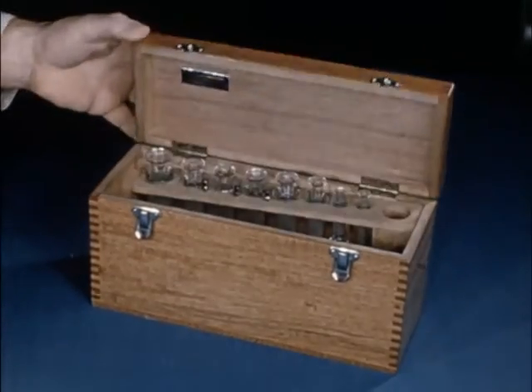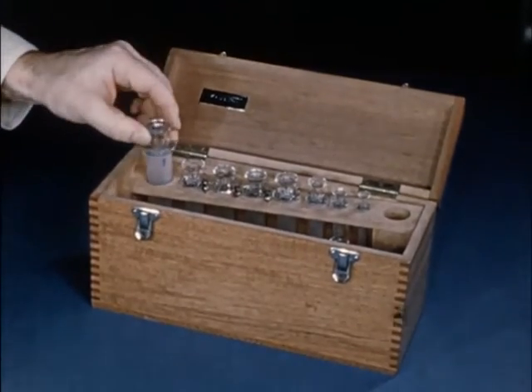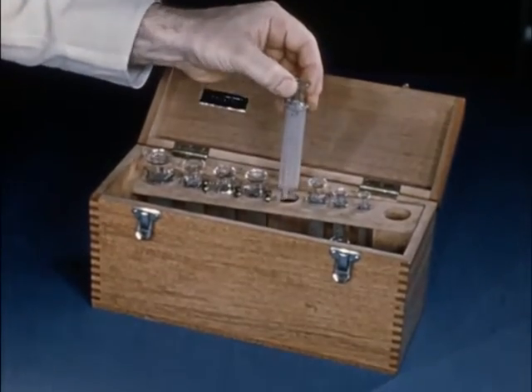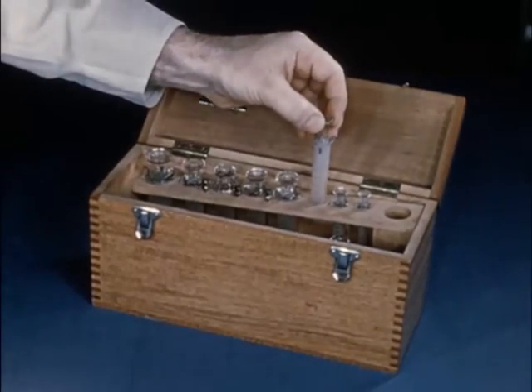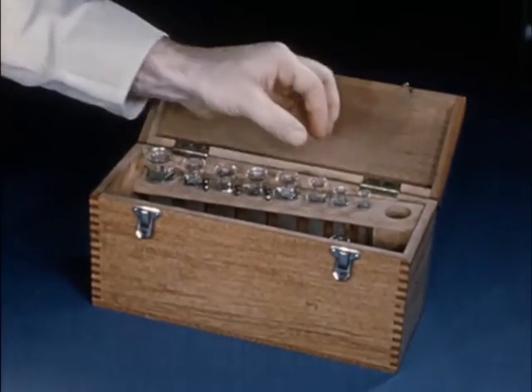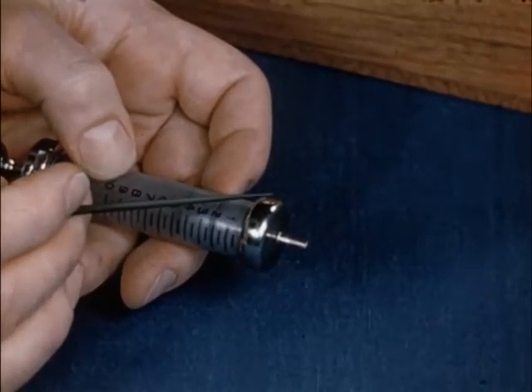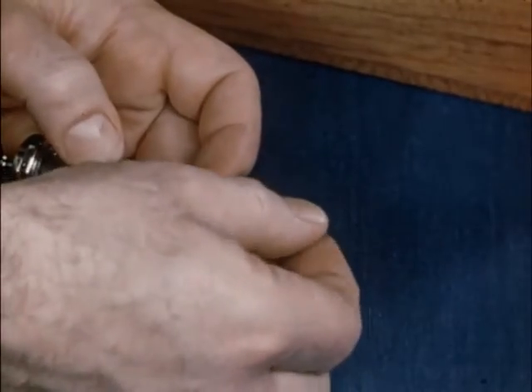The largest syringes required will be of 20 millilitres capacity. The smallest, 1 millilitre. Though the majority of requirements will be met by the middle sizes of 10, 5 and 2 millilitres. The size most used is 10 millilitres. Here is a common type with metal head and central nozzle. With it, a safe technique is well nigh impossible.